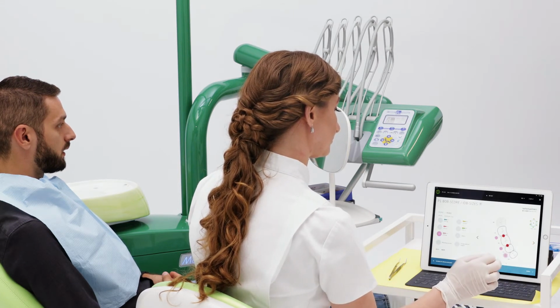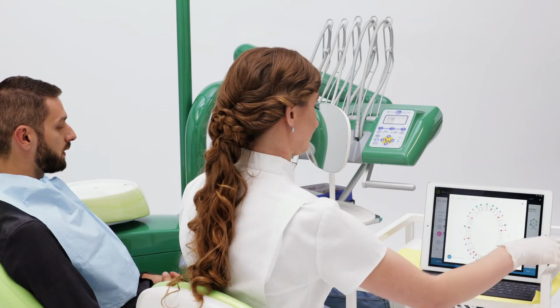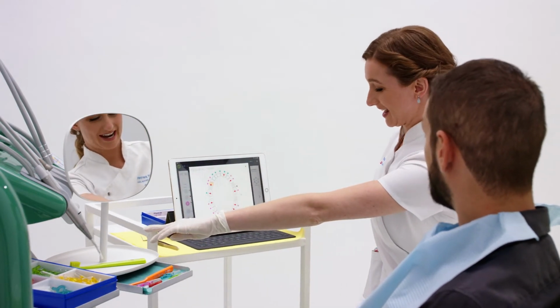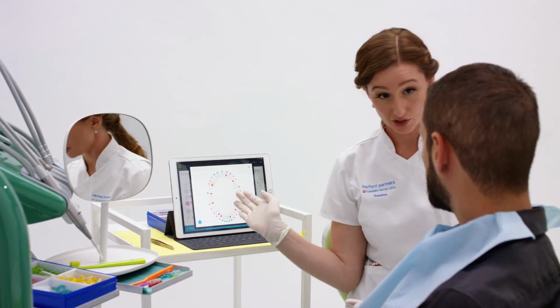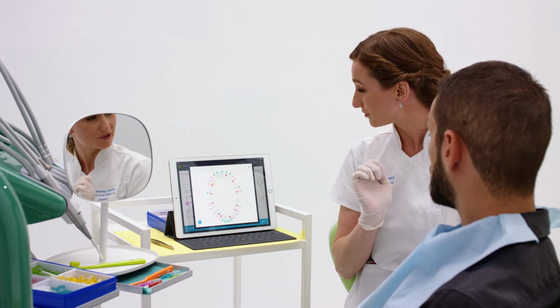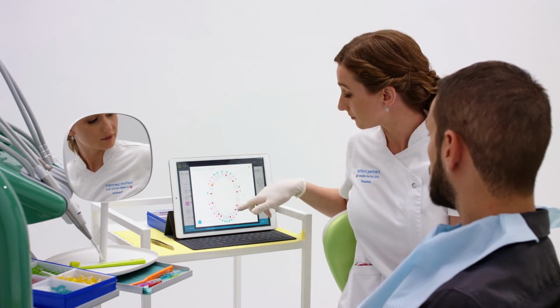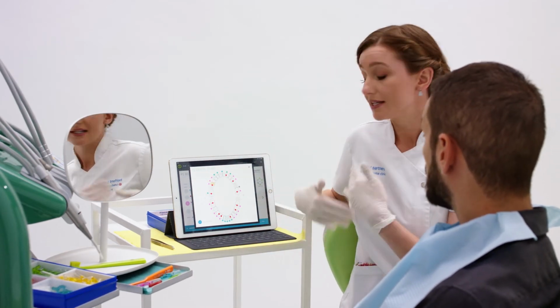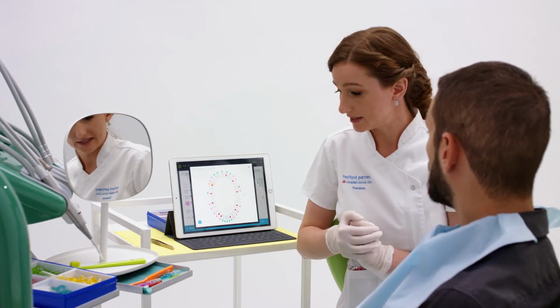I then bring up the full mouth map again, and by clicking the button on the lower left corner of the screen, I can place the mouth map into the patient view. I then share this view with the patient, who now has a mirror image of his mouth and an assisting mirror in front of him. He too can have an overall review of the interdental aids recommended and also what areas have shown signs of inflammation. I explained to Edward that we have 3 dental aids that will need to be used daily.